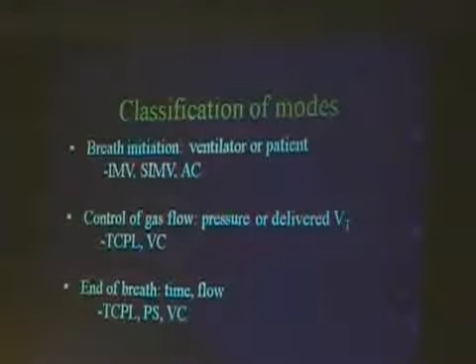Let me say that again. If you have an appropriate tidal volume and an inappropriate mean airway pressure, you will still damage the lung, because your lung will be overinflated or atelectatic, and that appropriate tidal volume is not going to prevent lung damage. Lung damage occurs from inappropriate mean airway pressures and from inappropriate tidal volumes. Both work together, no matter what kind of ventilation you're using.